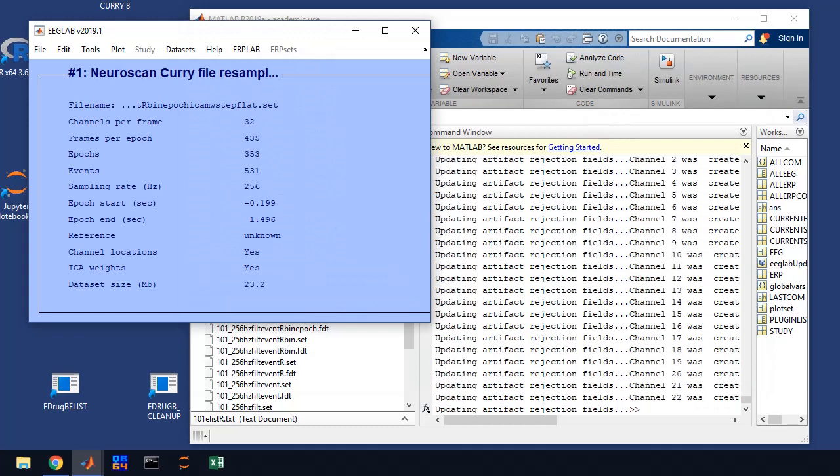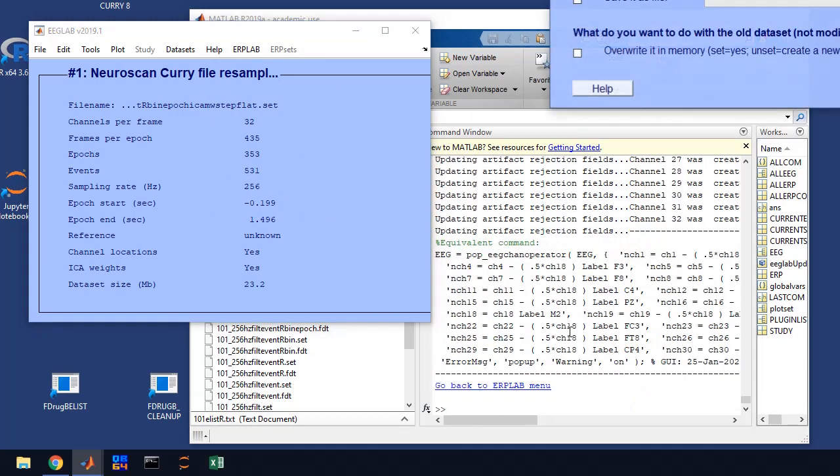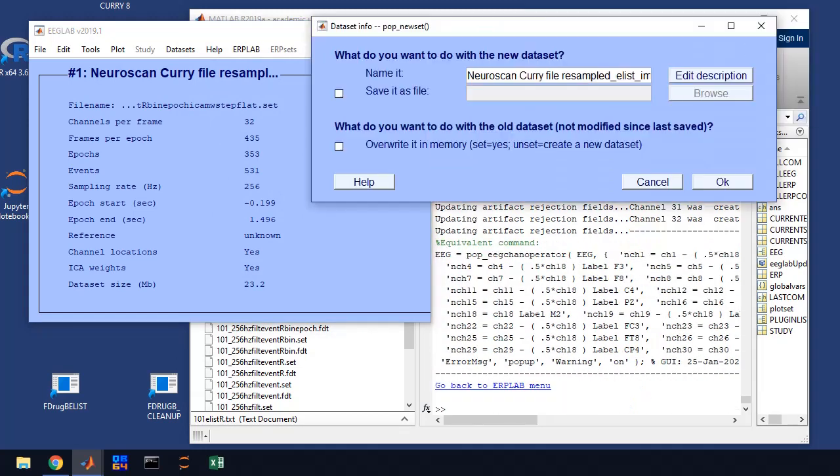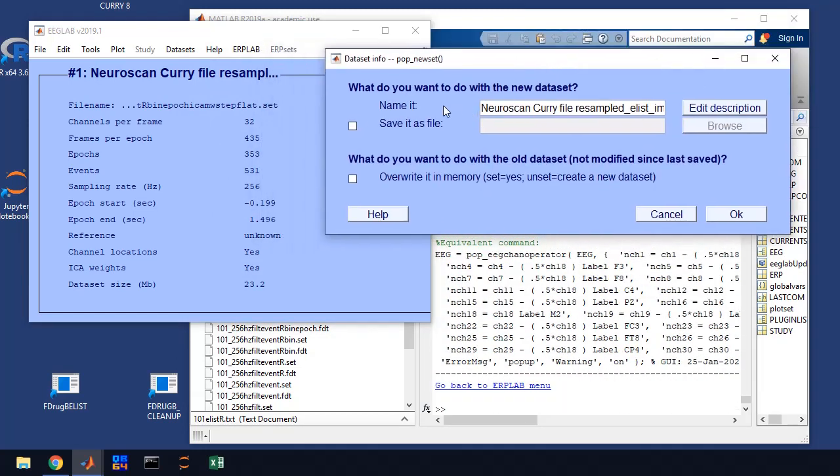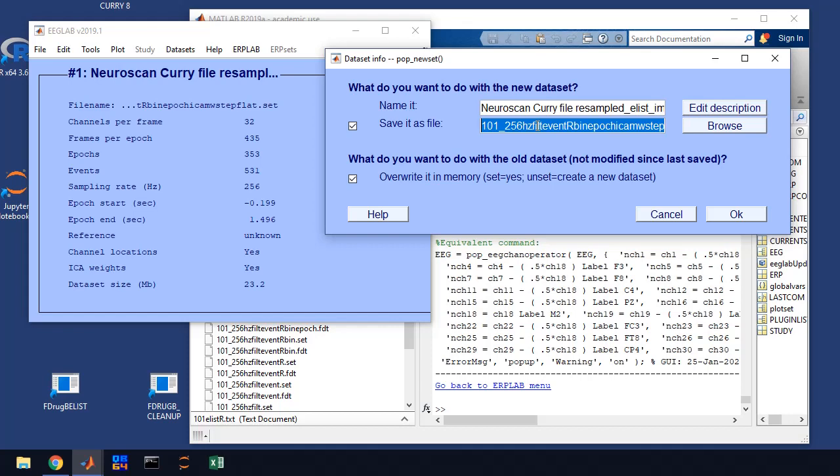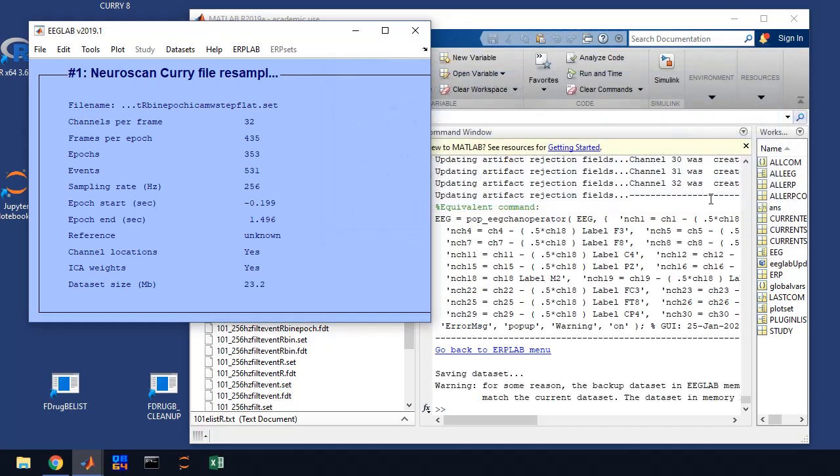We're going to go ahead and run this, and it's going to re-reference all of it, and you can see it's coming out down here, and it's going to ask us to save it. Save it, overwrite, and we're going to add to this re-ref is our file name, and we're going to click OK.